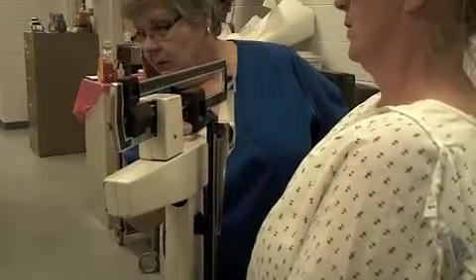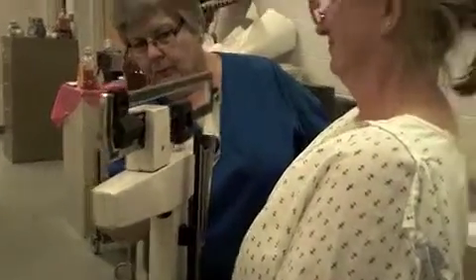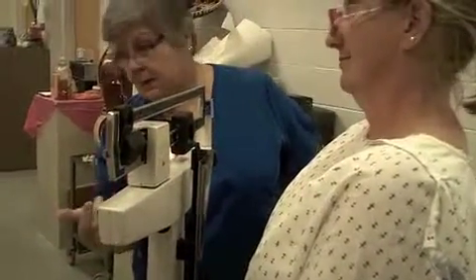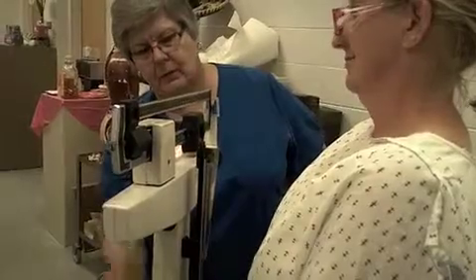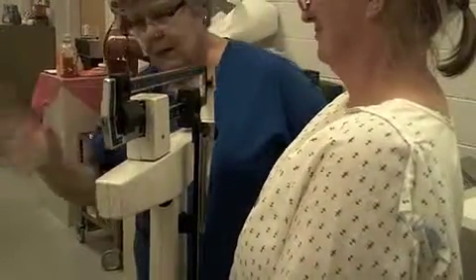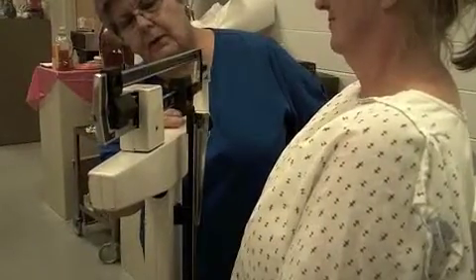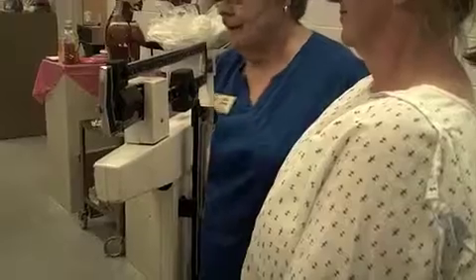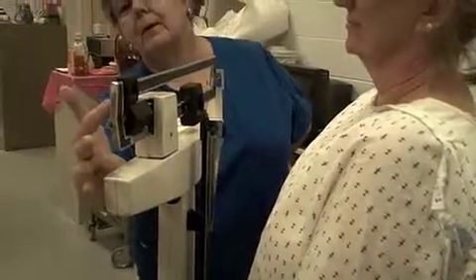You can hear it. You can feel it. It's in the groove. Didn't go down. Go to the next one. Didn't go down. Go to the next one. It went down. Now, with one hand, tell them to back it up 1 notch from where they were and not to touch it again. Come up here and move your top one.